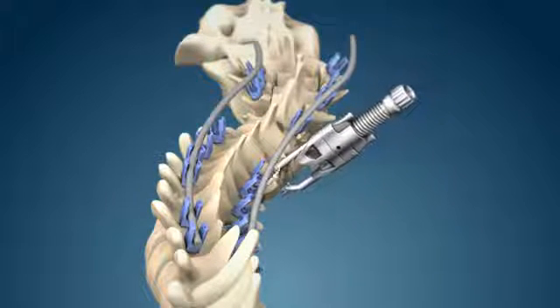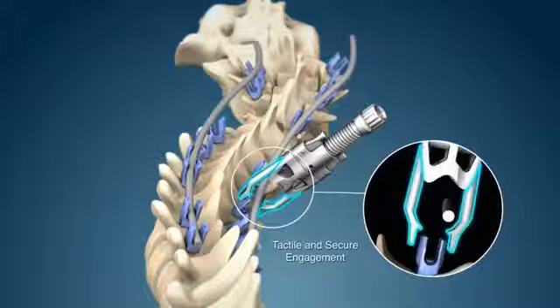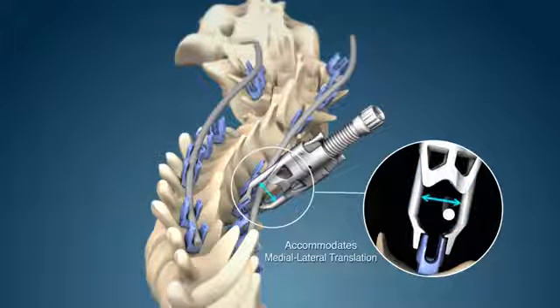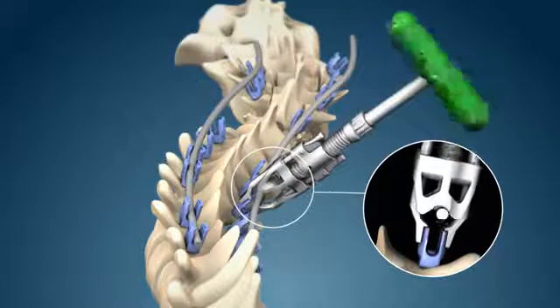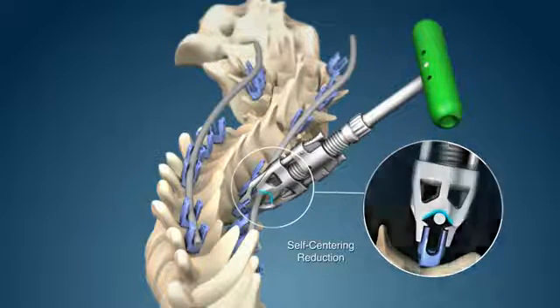A series of rocket reducers are positioned and capture the rods within the large containment window. The proximal barrel can be rotated until the anvil makes contact with the rod.